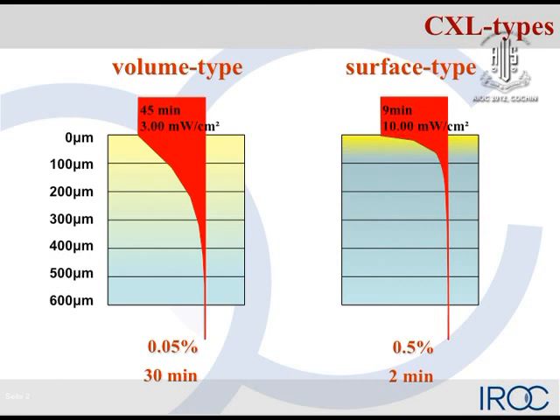If we add a higher intensity ultraviolet for a shorter period of time, the same dose but only shorter, which leaves the riboflavin in place during that time, for 6 minutes or for 9 minutes, then you get a very localized cross-linking effect.